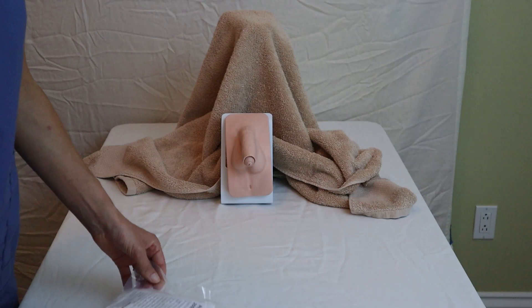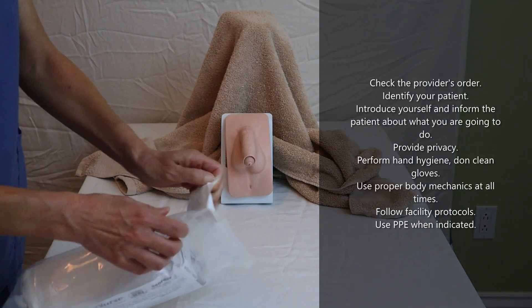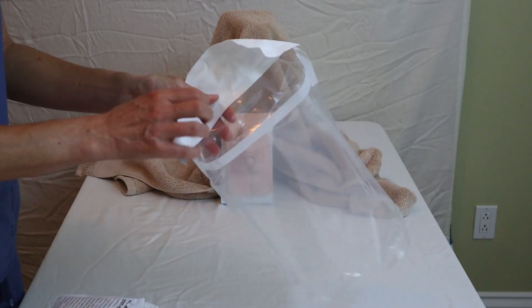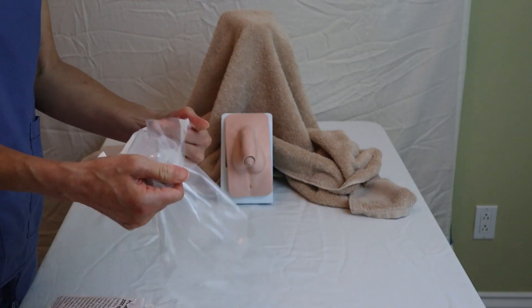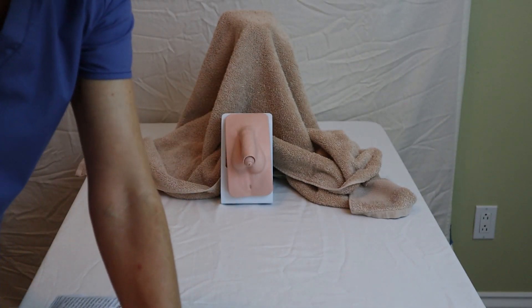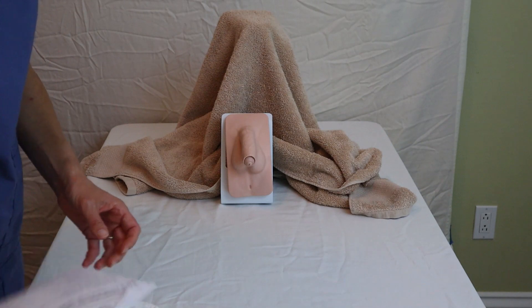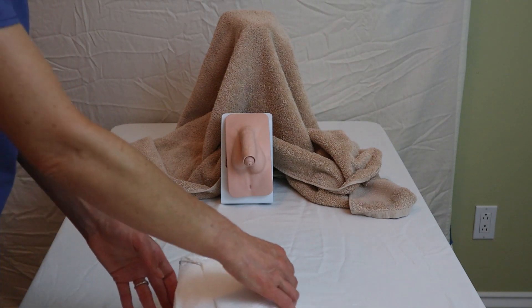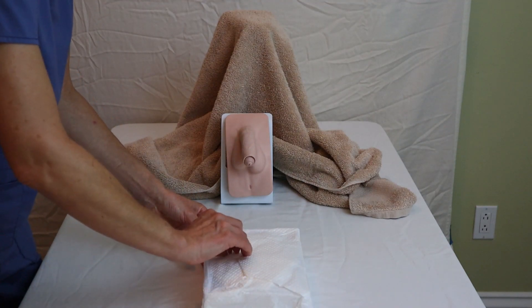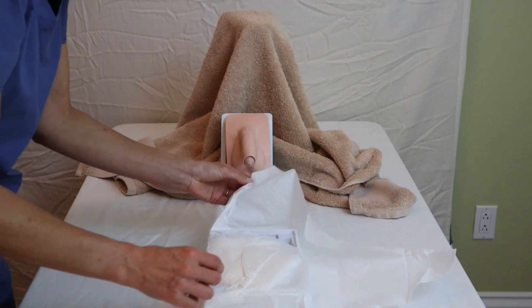To get started, we perform hand hygiene and then open up our package. This plastic bag that the package comes with can serve as a little trash bag — place it at the back of your bed so you don't have to reach across the sterile field. Remember that you always want to start by opening up your sterile field box by opening the package away from you, then opening each side.